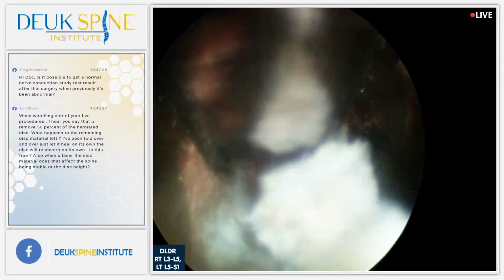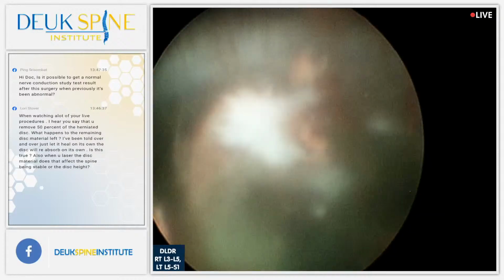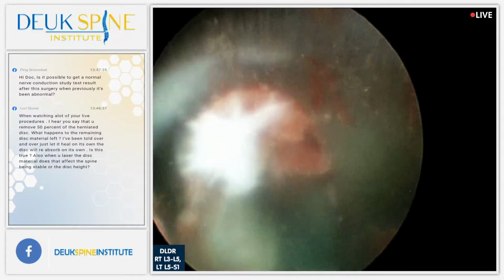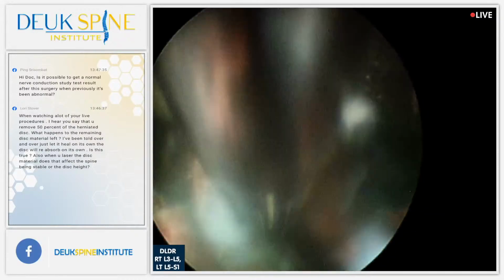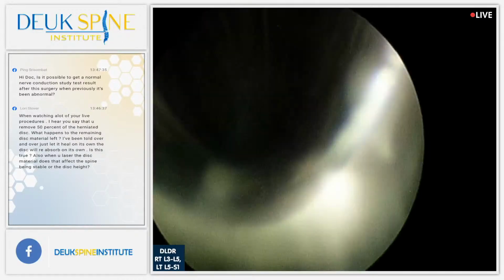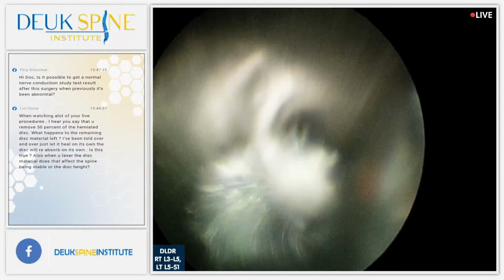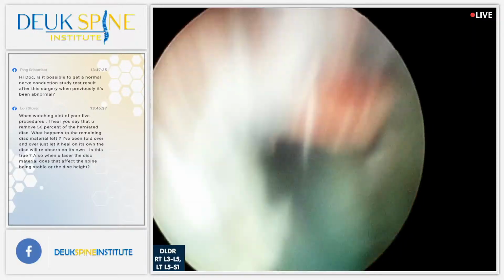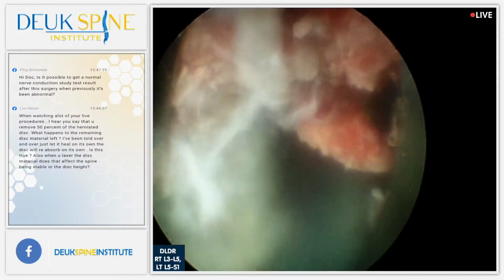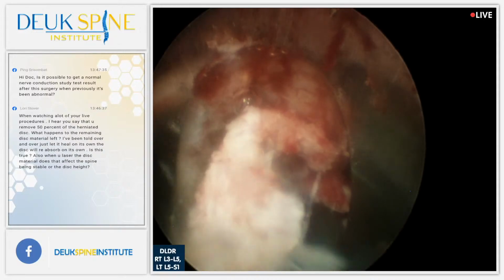I think the irrigation is sluggish. Please check all the connections. Can you check the lines? Check the line, please. Yep. It's very sluggish. Is it clipped here? No? Davis, you want to help them? Not in here. Over there. Has to be back there. On the Y, whatever the Y connection is. Check. All right. Let's see the grabber.